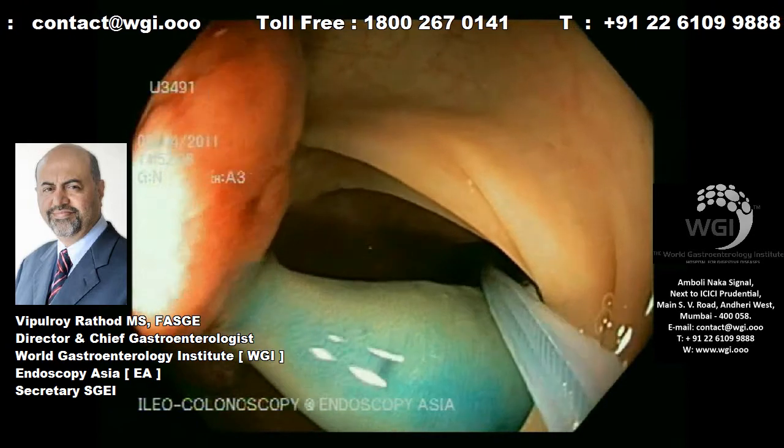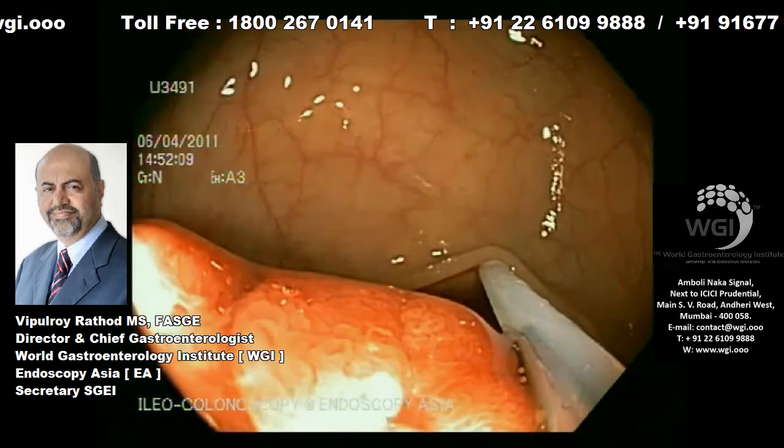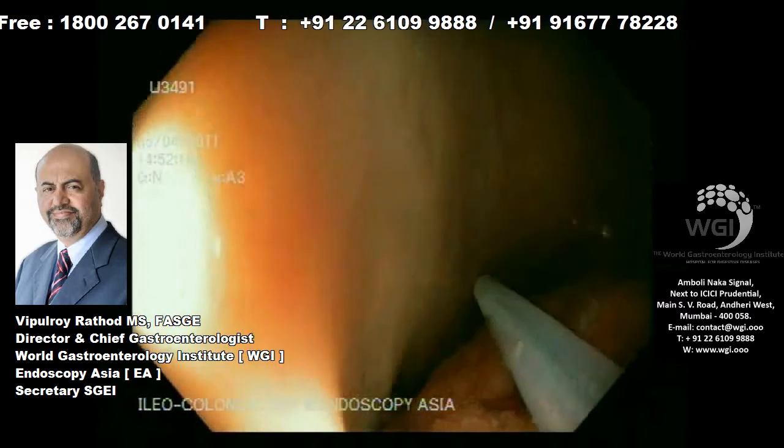You can raise the submucosa with saline adrenalin as well as with indigo carmin to stain the submucosal plane. Once you have injected, we will now use a snare — the largest possible snare. This polyp measures around 3 centimeters with multiple lobes.